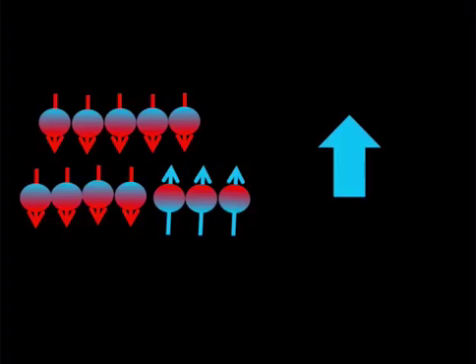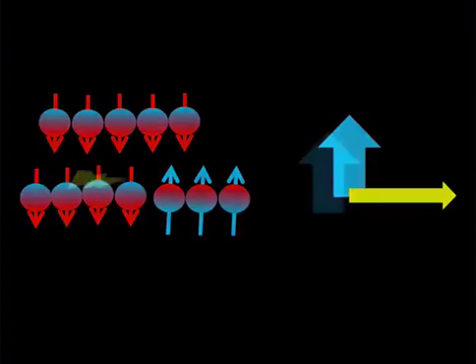Now, the angle to which the net magnetization vector moves out of alignment is referred to as the flip angle. And this depends on both the amplitude and the duration of the RF pulse. So what does that mean? It means that because more of them are pointed away than are pointed with, you've got your vector that is now also pointed away. This would be in alignment, this would be away.